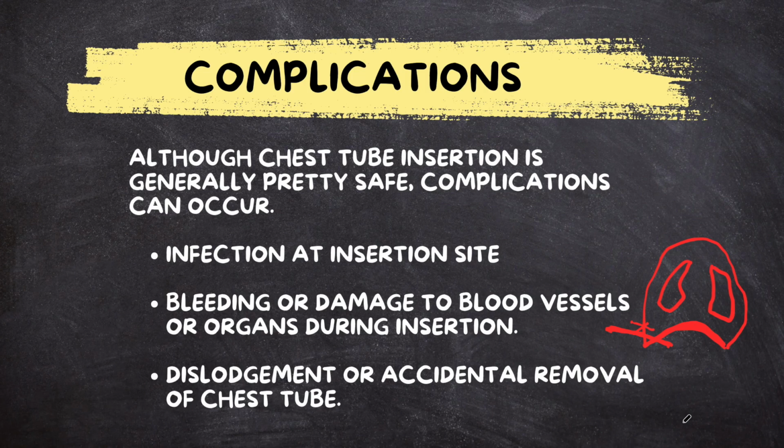So the ideal placement is above the rib, because then you avoid all those key components. You don't want to put it in on the underside and nick one of those arteries, and then you've got a huge bleeding problem, potentially, depending on your coags and stuff like that. But I just thought that was an interesting fact. Shoot on top of the rib versus underneath.